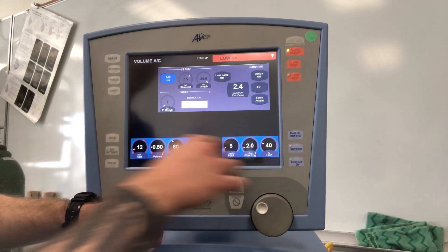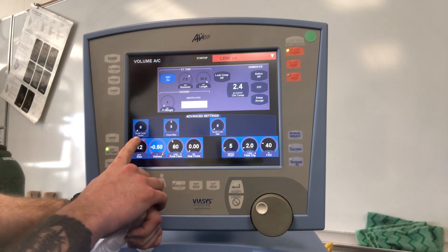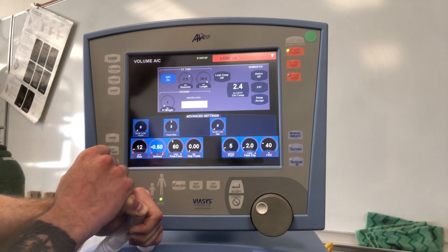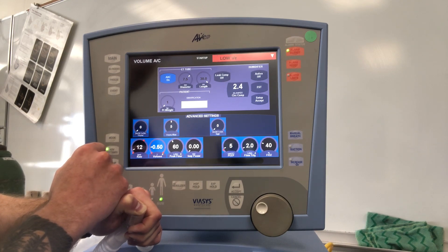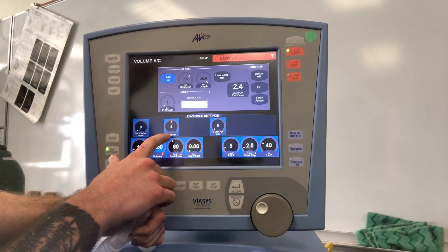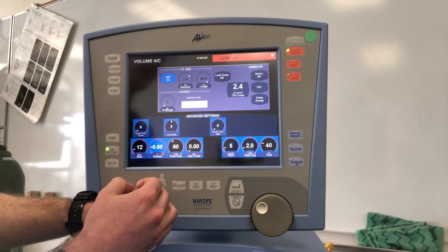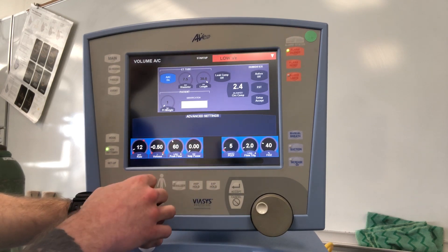Advanced settings allows you to jump into extra menus. Under volume, you have the option of V-Sync, which is basically PRVC. We recommend keeping V-Sync off because it causes confusion and can be disingenuous. V-Sync rise is your actual rise on those PRVC breaths. We also have the option of turning a sigh on or off — the sigh gives a breath every hundred breaths at one and a half times the original set volume.